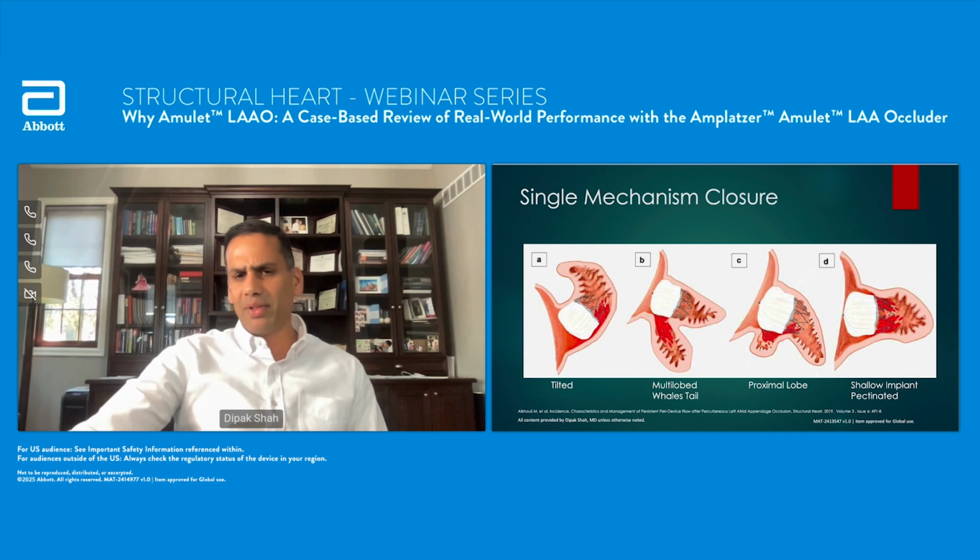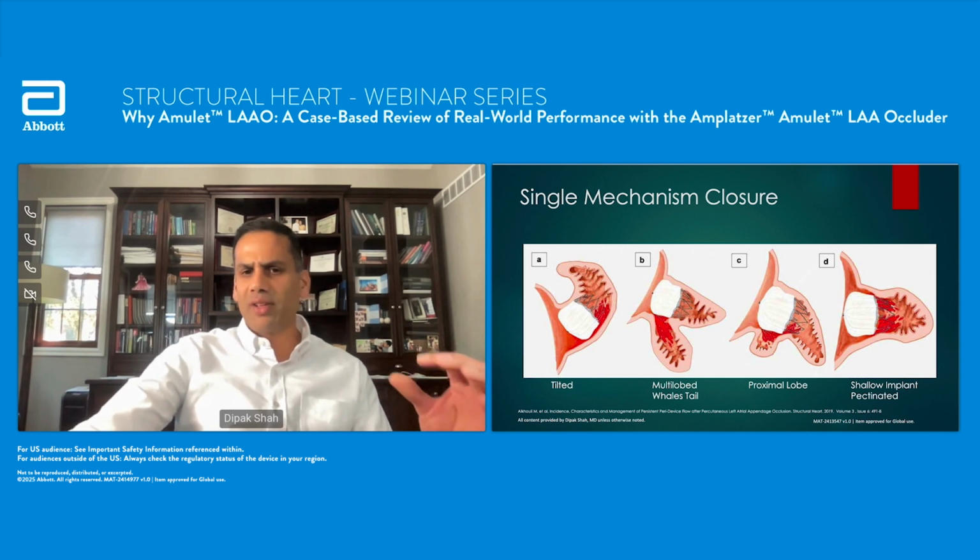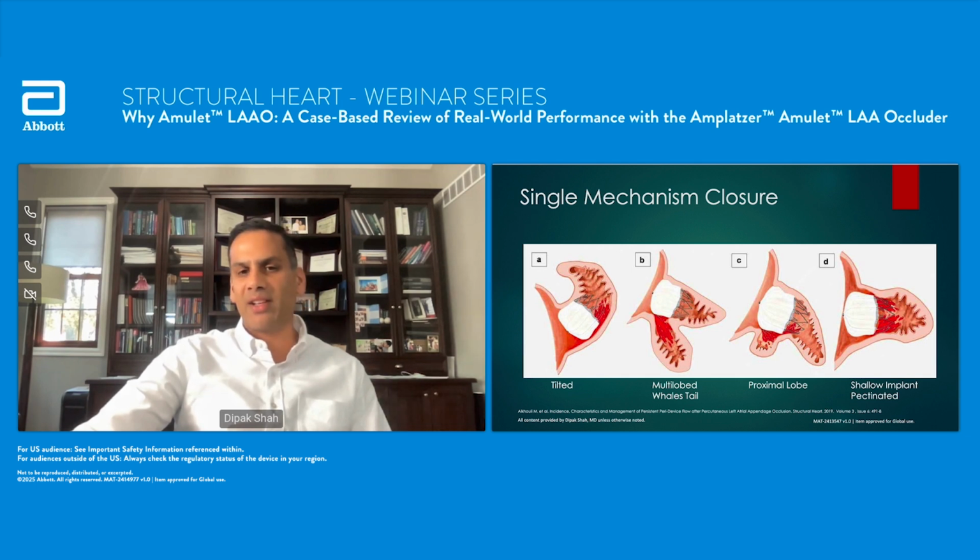The other example, again, is a shallow implant or something that's heavily pectinated. Sometimes you can't appreciate how the pectinate is going to interact with the device. If you put a Watchman in, often it turns into a hot dog shape. You've got compression all through, but a circumferential leak around the device. So you're really in a bad position with that type of implant.